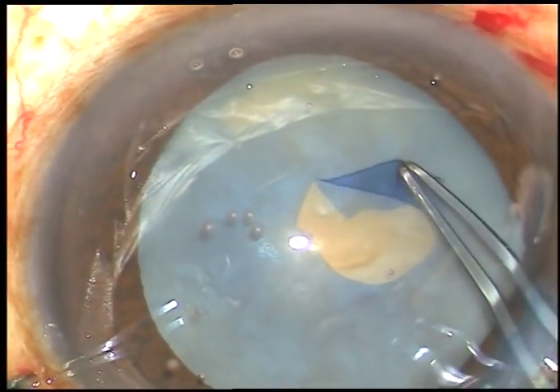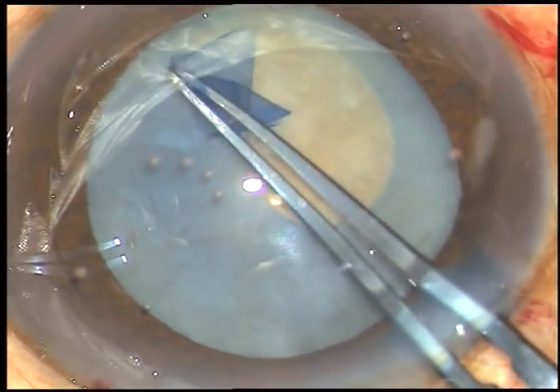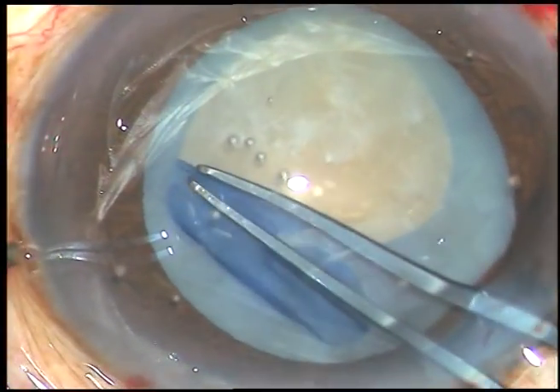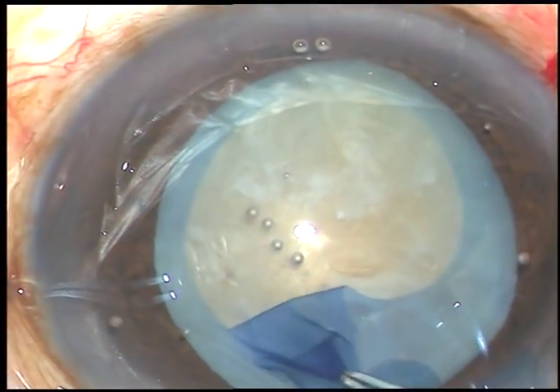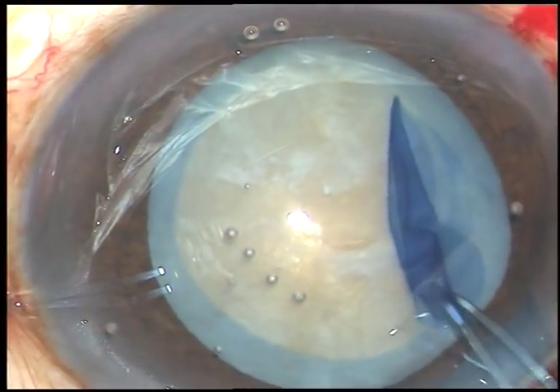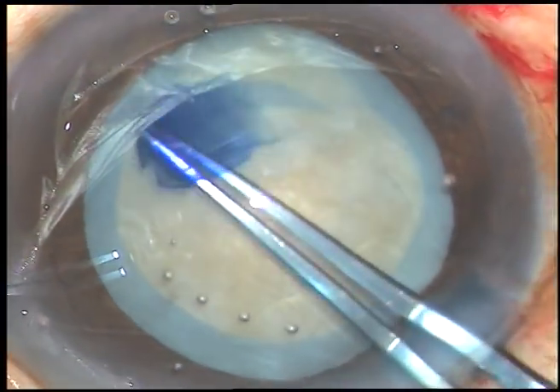Now, I hold this flap with the utrata forceps and go anticlockwise — you can go clockwise. I go anticlockwise and perform the continuous curvilinear capsulorhexis. That's it. The rhexis is complete.